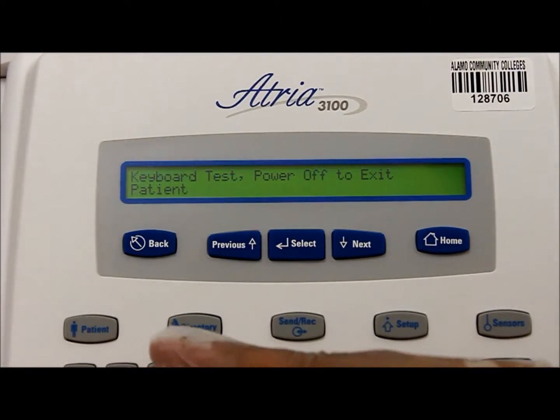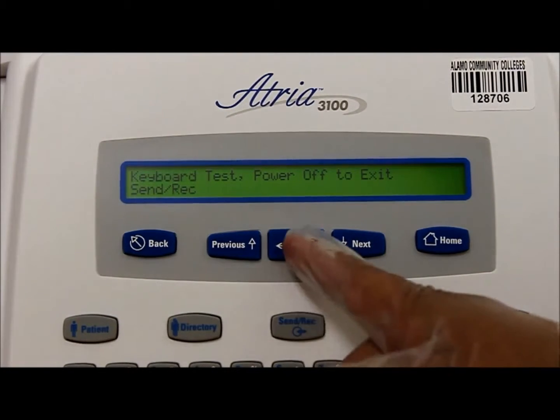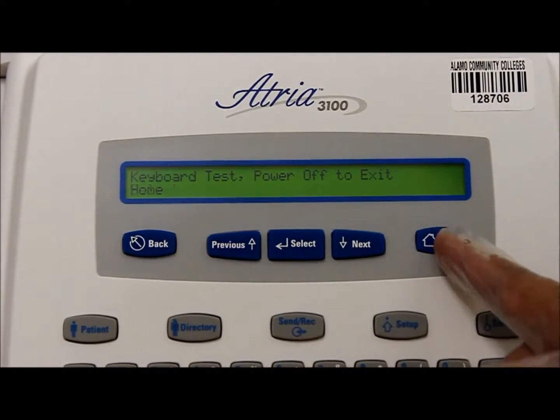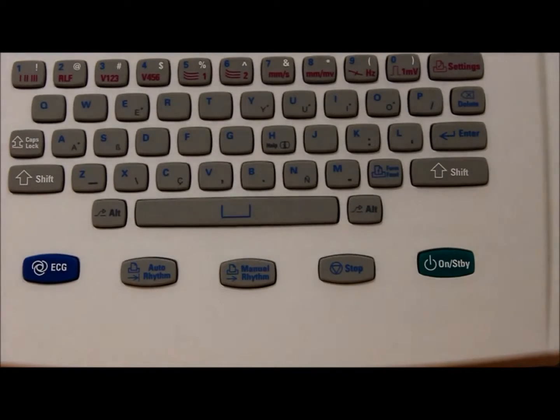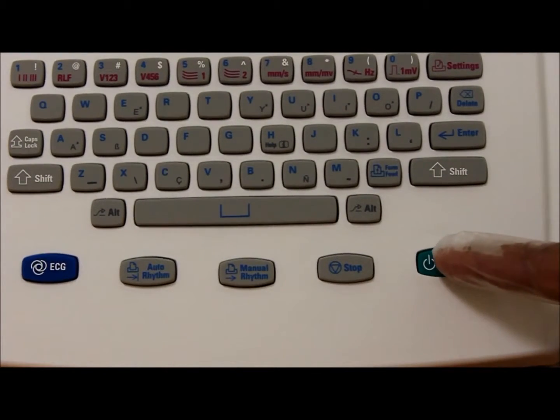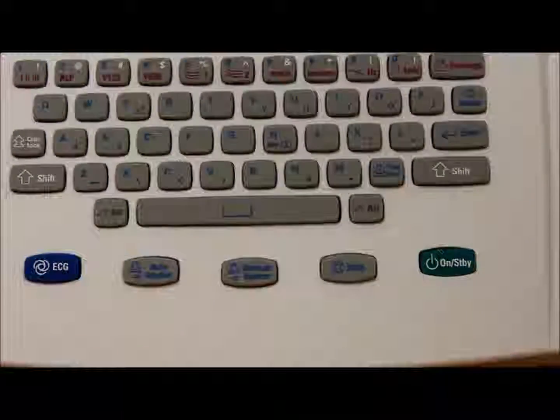Keyboard test. To run the keyboard test, press each button on the device and compare it with the output shown on the display. Do inputs match with the output? This test is designed to ensure that the keyboard is functioning correctly.